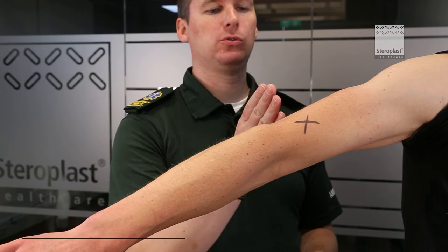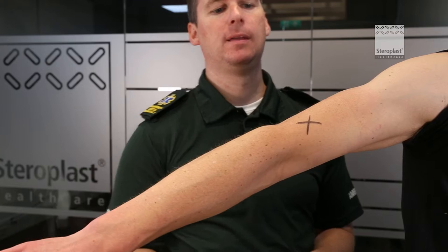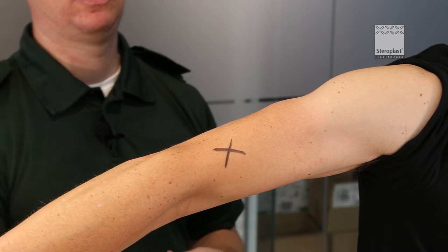So if our wound is where this X is, we're going to place our improvised tourniquet two or three inches above that. Take your triangular bandage out of the packet and roll it so it's nice and thin and flat.